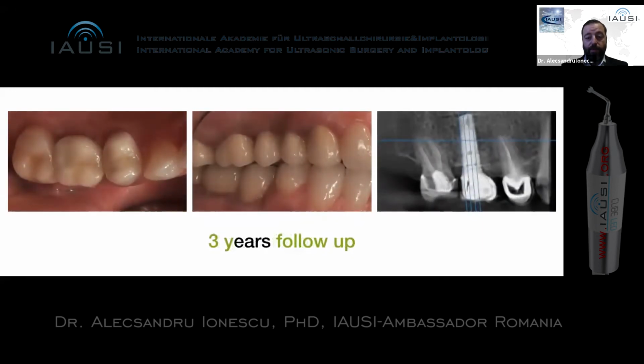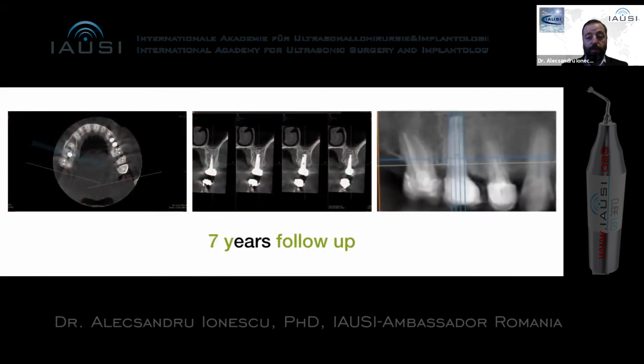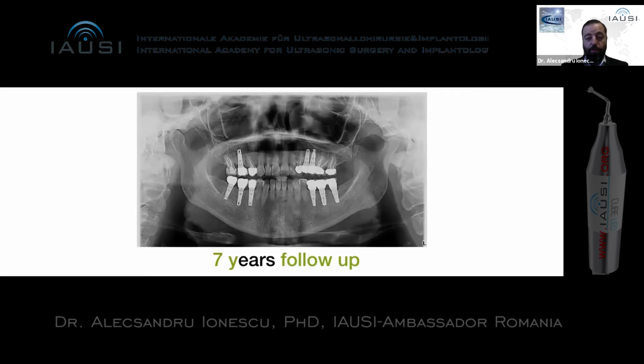It's a 3 years follow-up. Again, it is very stable. 5 years follow-up. There is no modification. And a 7 years follow-up. It's very nice when we have follow-up with good condition after so many years, and that is why we trust our approach and concept.